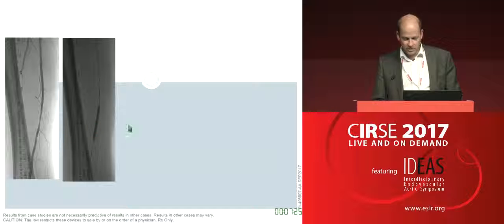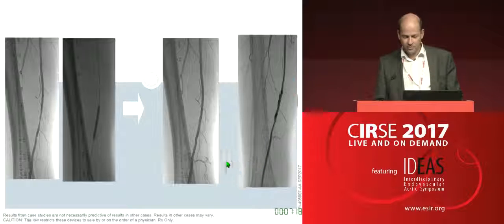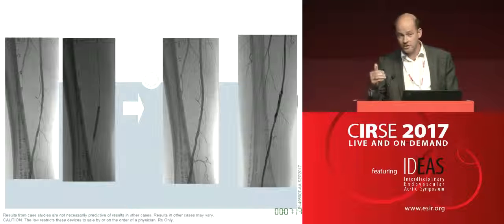But we treated this with a drug-coated balloon. This was the result after the intervention, and then I already showed that this is the follow-up. The follow-up at 6 months was a positive remodeling.